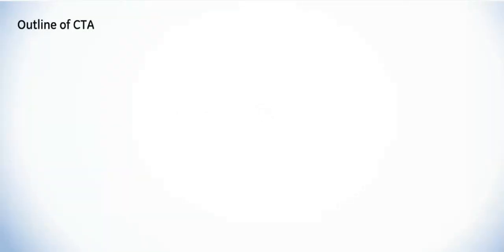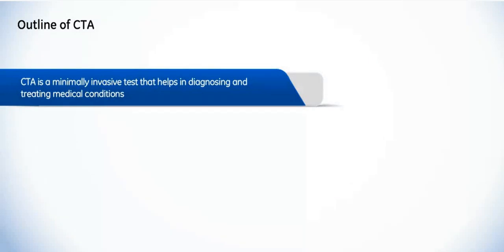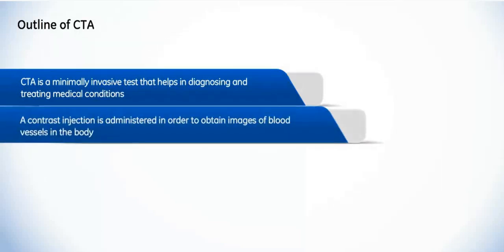We shall now discuss CTA. CTA is a minimally invasive test that helps in diagnosing and treating medical conditions. Here, a radiopaque contrast agent is injected into the body, following which images of the blood vessels are obtained utilizing a CT scanner.